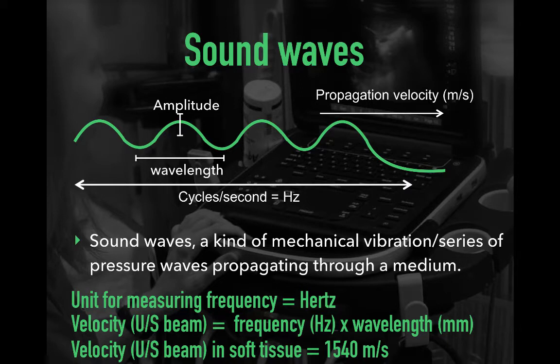What are the clinical implications? Essentially, short wavelength ultrasound offers the best resolution, but there is much difficulty penetrating bodily structures, so it doesn't offer a lot of deep tissue visualization. Long wavelength ultrasound can penetrate more deeply, with much less resolution, and each ultrasound transducer will have a characteristic frequency. This is akin to FM or high frequency radio versus AM or long wavelength radio, where we can see the differences in range and quality of acoustics.